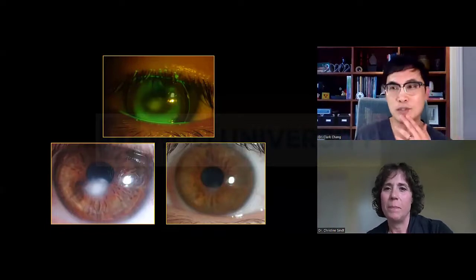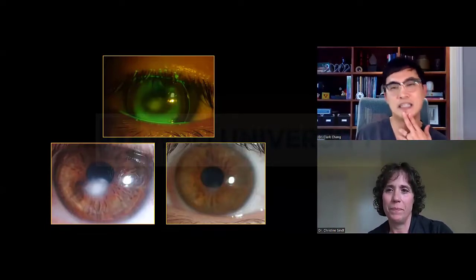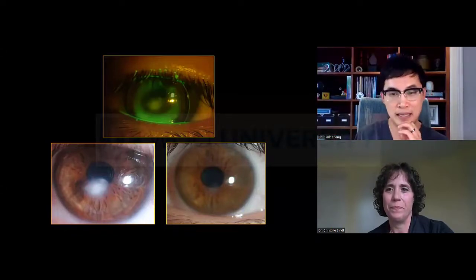So, always make sure that we cross-check our findings with the definition of the disease in order to guide us in selecting lenses for patients.